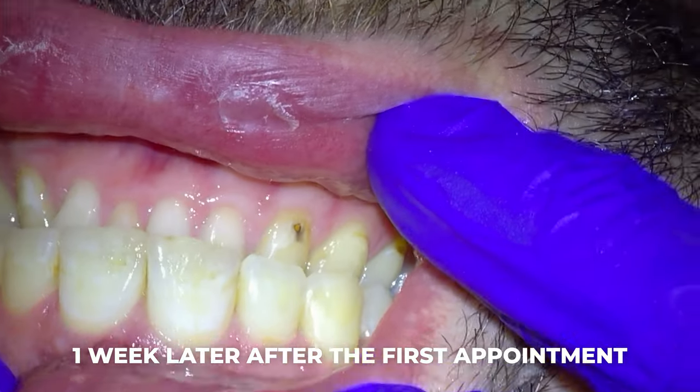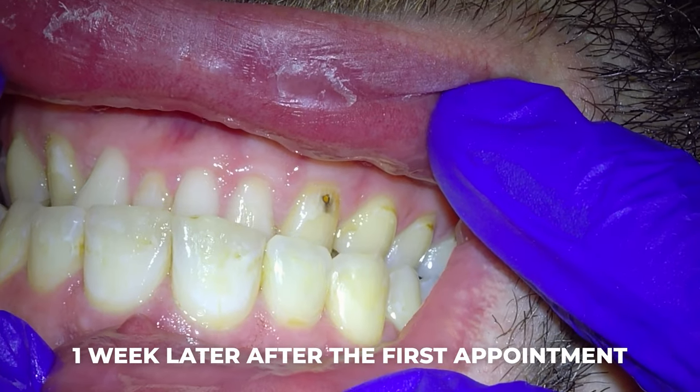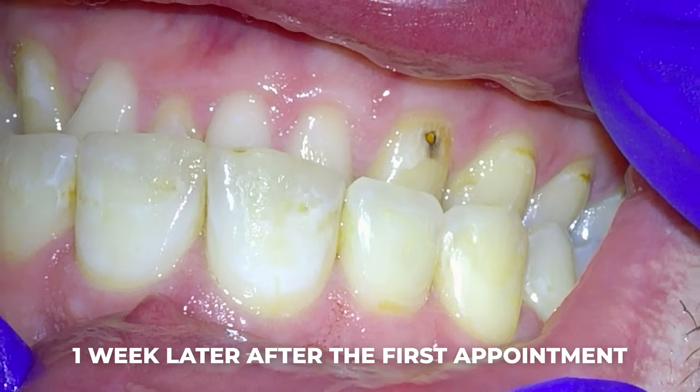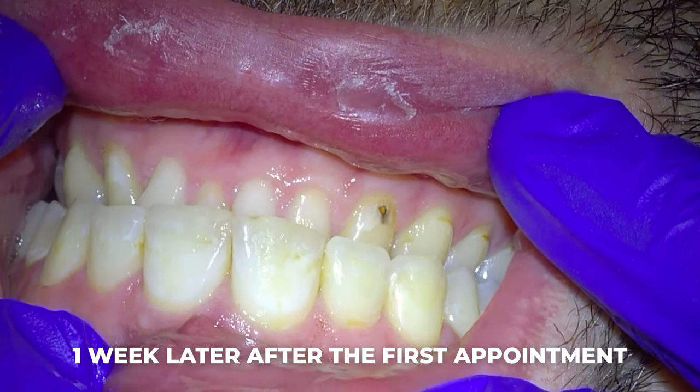He's so happy with the way the ones we did today look that he immediately schedules to have the other white spots taken care of as well — those will be done for purely cosmetic reasons. To prove that white spots are more prominent when the tooth is dry, this is what his front teeth look like a week later, right before we do the other white fillings. You can see that a lot of the white spots are gone, and the really prominent ones from the end of the last appointment are now barely there. So if you want to see the final results, you'll have to go watch that video.